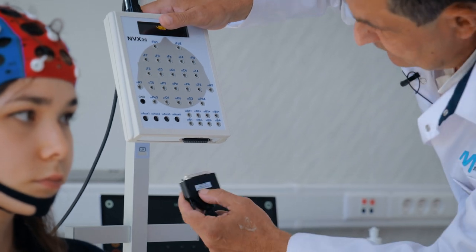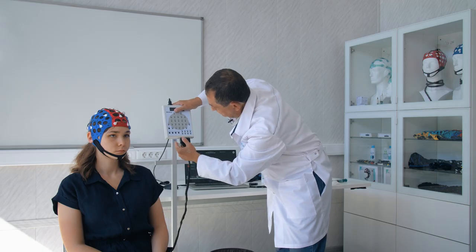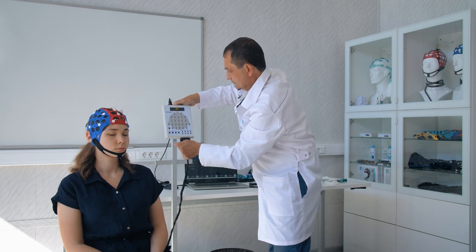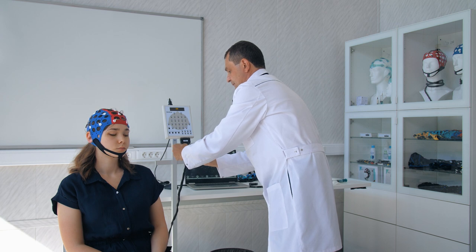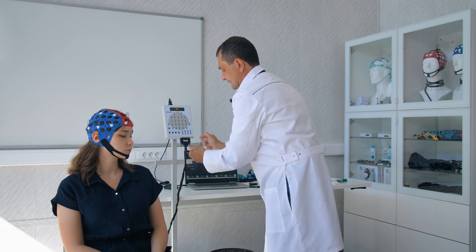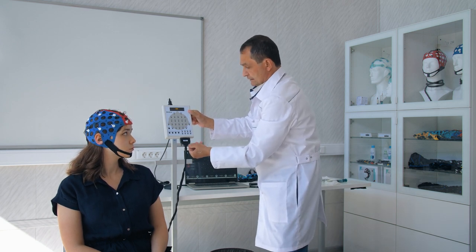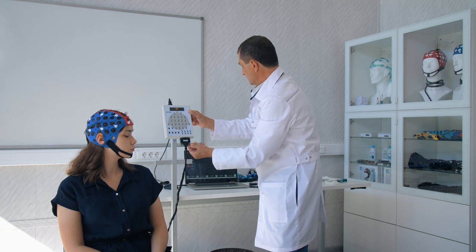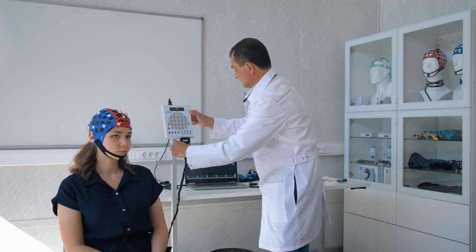Please establish a connection by connecting the cable connector of the cap to the input connector of our EEG machine for accurate data transmission and analysis. If deemed necessary, proceed to tighten the screws to ensure better and more reliable contact between the components of the system. By employing software, we commence the procedure of pouring gel into the electrodes, ensuring precise control and accuracy throughout the entire process.